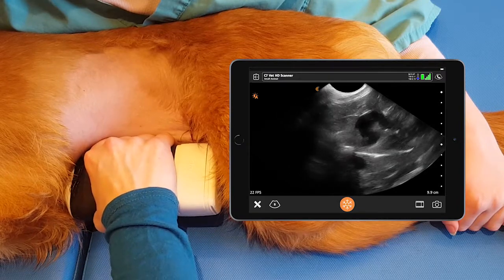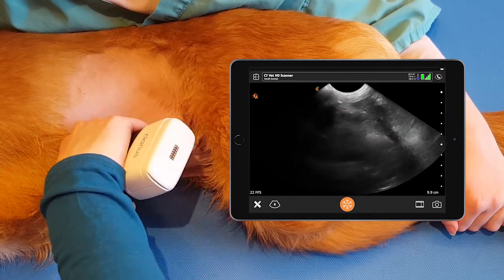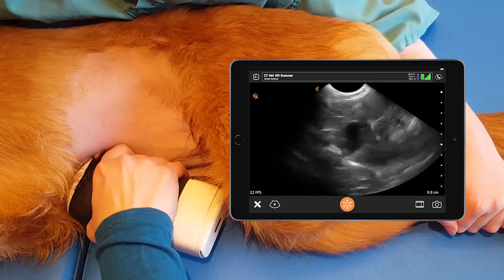If we rock cranially we get the cranial border of the liver, and we can fan all the way down, all the way up through the gallbladder until all the liver has disappeared.